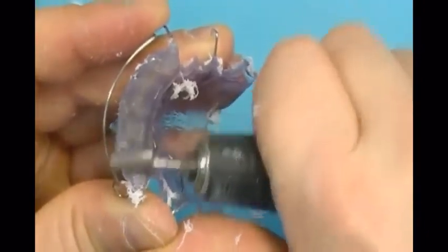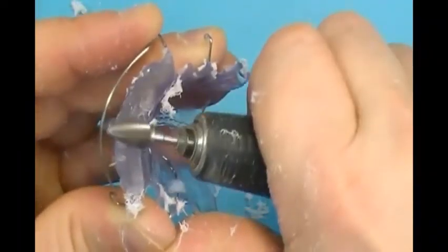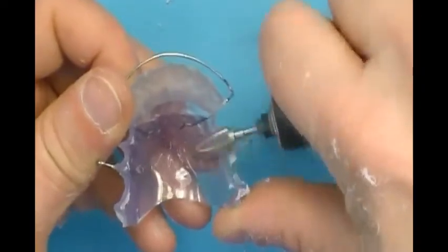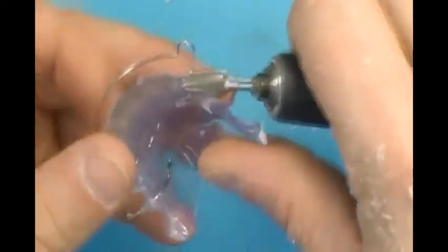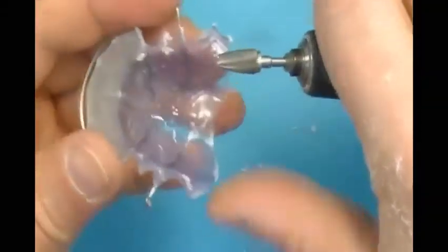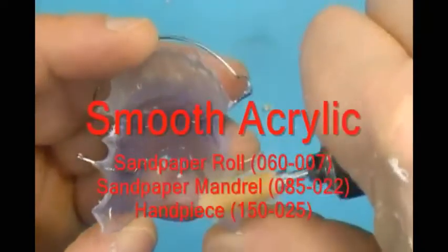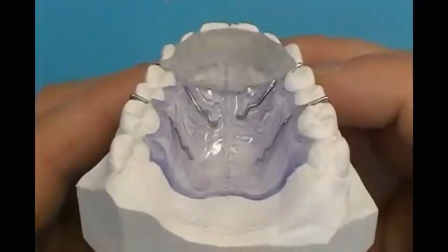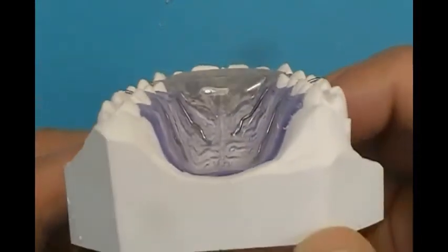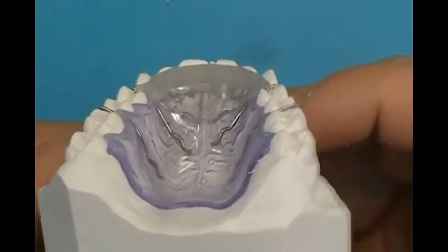Flatten the acrylic to the prescribed height along the anterior teeth. Finally, the scalloped posterior and rounded anterior segments are blended into the retainer body. A sandpaper mandrel with a 3-inch strip of 150 grit sandpaper is used with a lab handpiece to smooth trim surfaces.